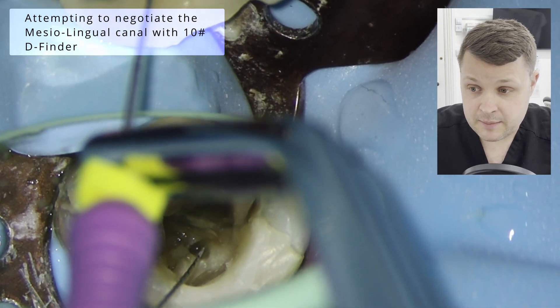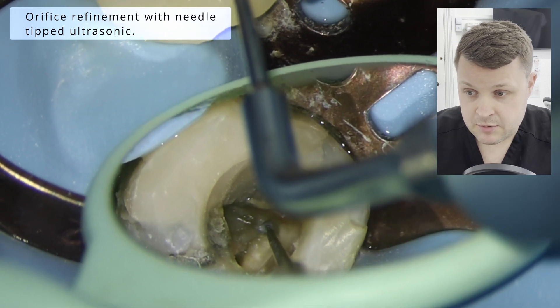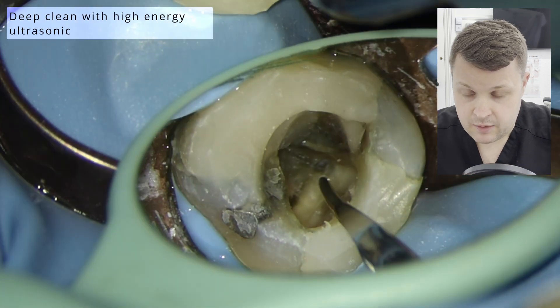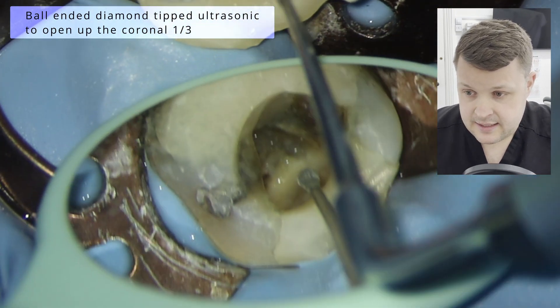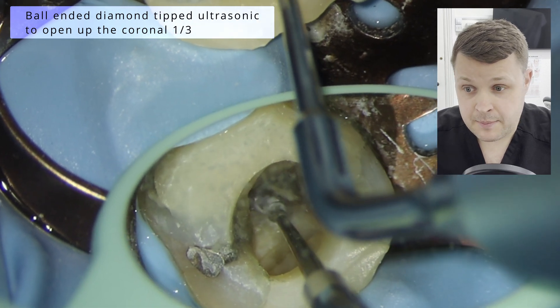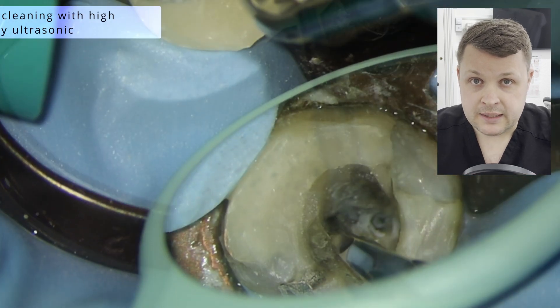To try and negotiate these canals, I'm using a D-finder. In succession, we're using the D-finders and these needle-tip ultrasonic tips, just to have a little look around and see if we can feel a nice drop into the canal space. And again, we're going to use the high-energy ultrasonic — the amount of times I've used a high-energy ultrasonic and it just drops into the canal. The endosuccess tips are really, really good because they've got loads of different ends on them. The first one was kind of like a torpedo shape, then a needle tip, and this one's like a ball-ended ultrasonic tip — it works in the same way you'd use a Gates Glidden bur, but with much more control.